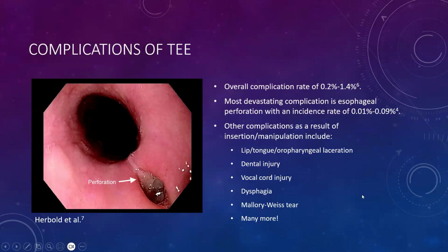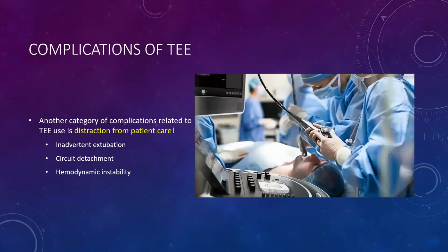Other complications, the less serious ones, right? Oropharyngeal trauma, laceration, dental injury, vocal cord injury. You can cause a Mallory-Weiss tear. There are a number of other complications, but the one that everyone is always worried about is going to be your esophageal perforation.